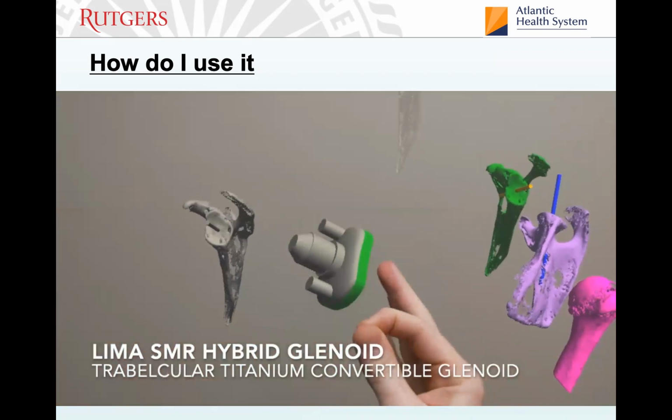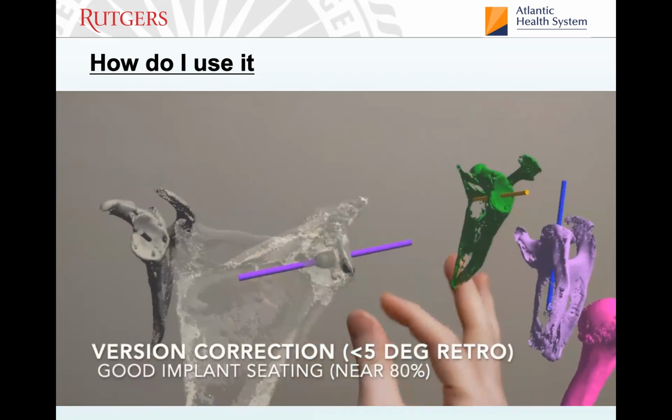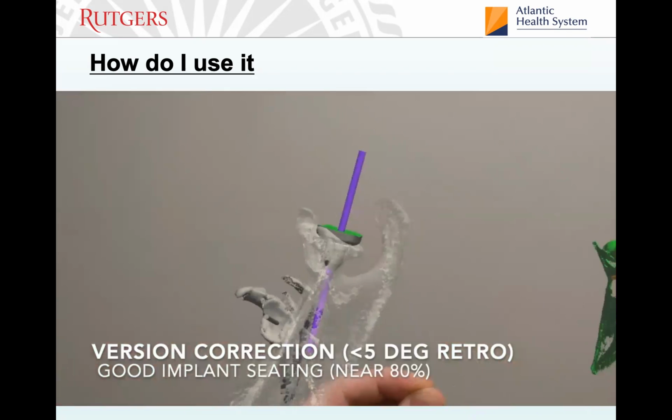preoperative plan. And this is where I think most of the value of this technique is still preoperative planning, to really know before you go, your implants, every single part of the surgery sort of played out in your head ahead of time. But there is a component of intraoperative execution and checking things that I think is helpful as well. And it seems to add no morbidity to the patient. It's just something you can wear on your head and do in a case without adding significant time or problems to sterility. So.